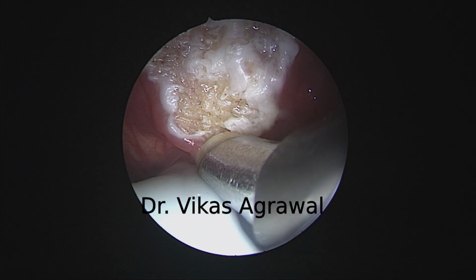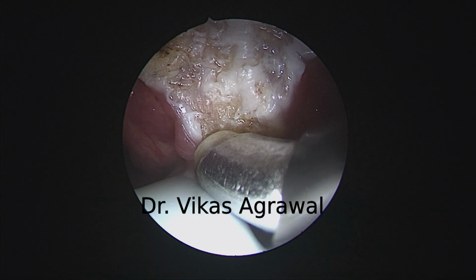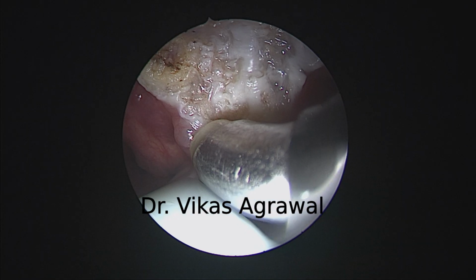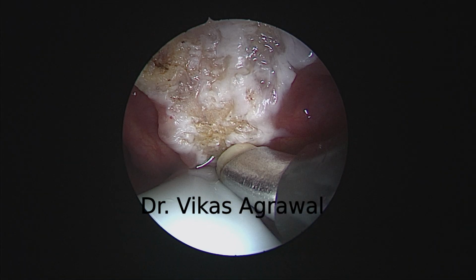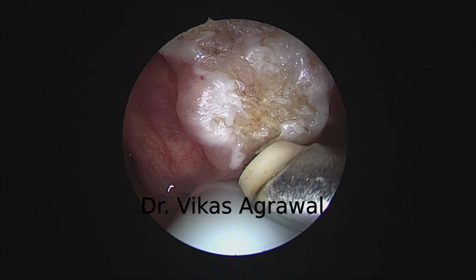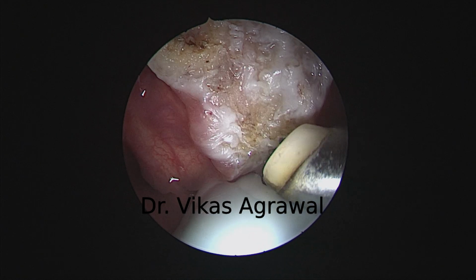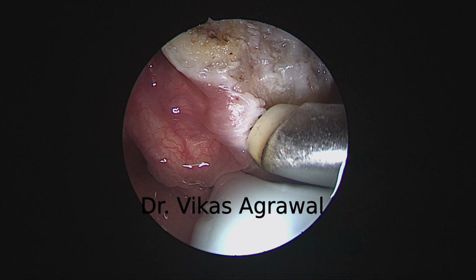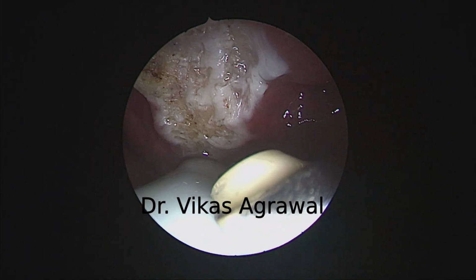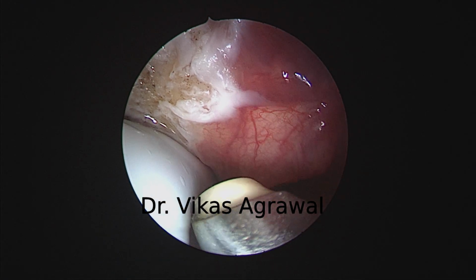Now my next step will be to pull out the epiglottis. Alright. I'm just following up the tube. While intubation, because it was so retroflexed, the epiglottis just went inside. Can I have some? Oh, this is the epiglottis.